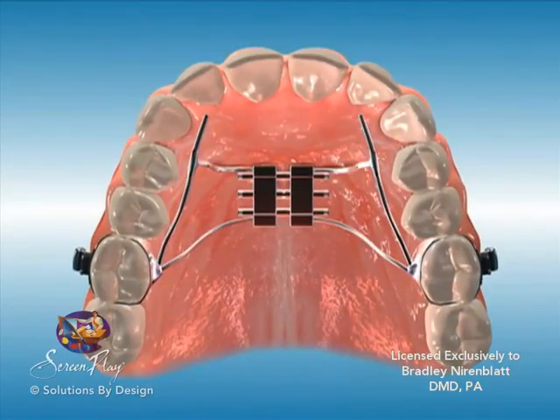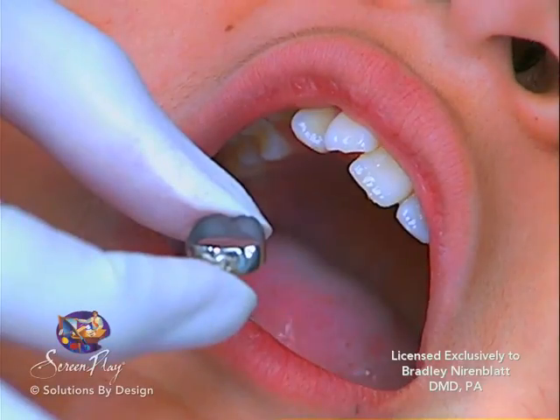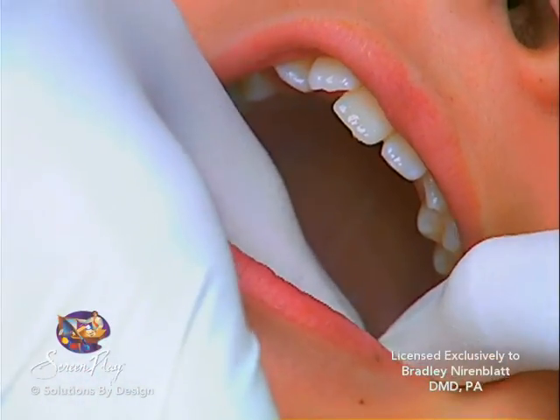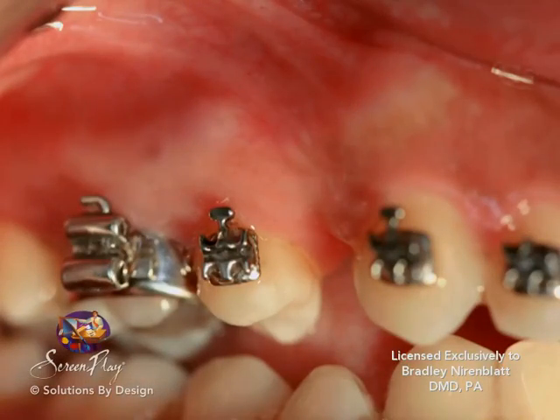Typically, the first step in the application of braces is the placement of molar bands, when and if it is determined that bands are indeed necessary. Molar bands require a space between the molars to allow the bands to be applied.